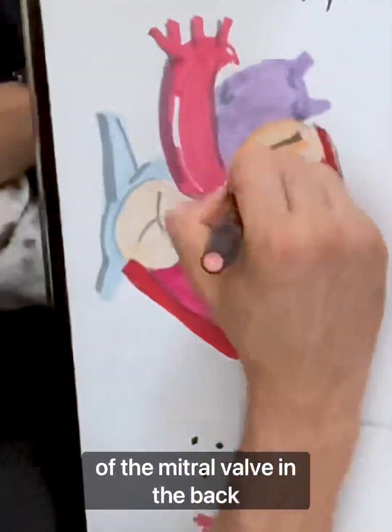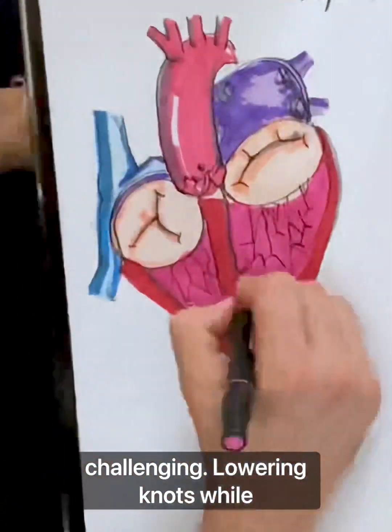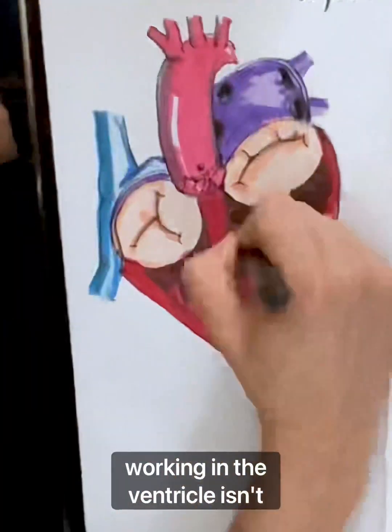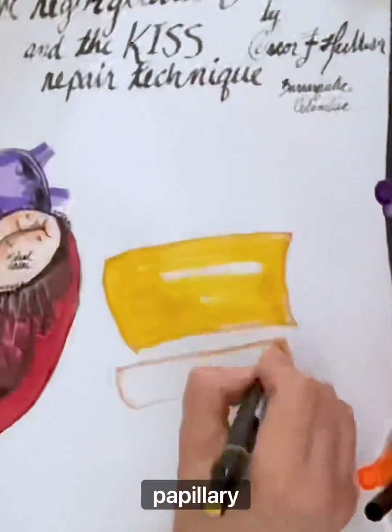I want to highlight the location of the mitral valve in the back of the heart, making surgery challenging. Lowering knots while working in the ventricle isn't straightforward. This is particularly true when dealing with the anterior papillary muscle.